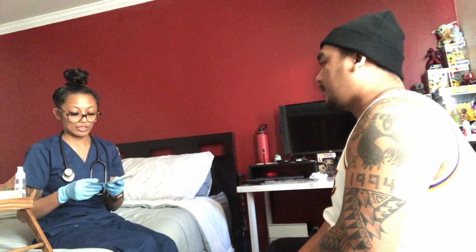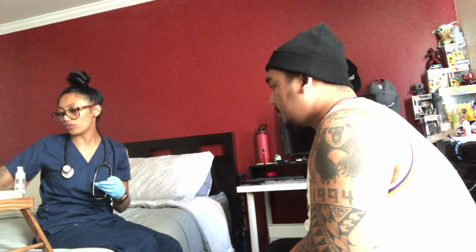Okay. And some side effects that you may feel with this one is that you may get a headache or you may feel dizzy.